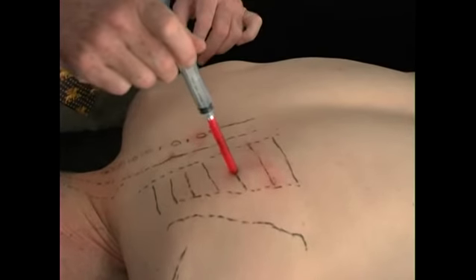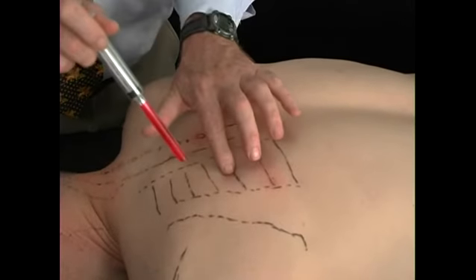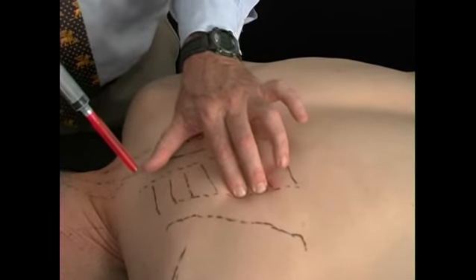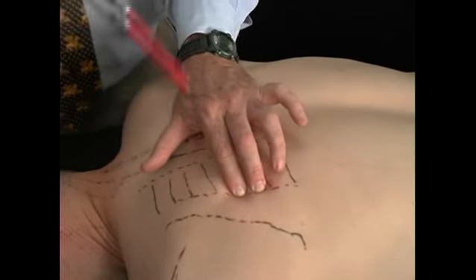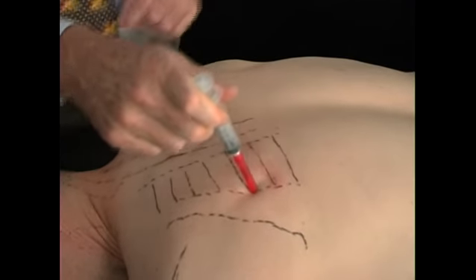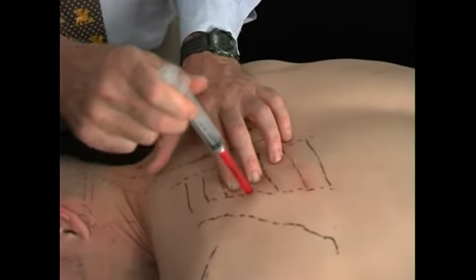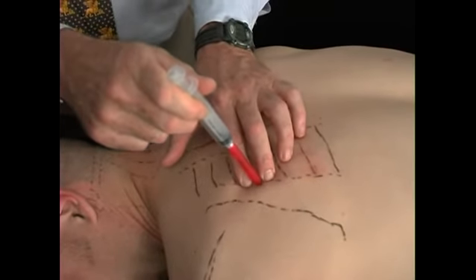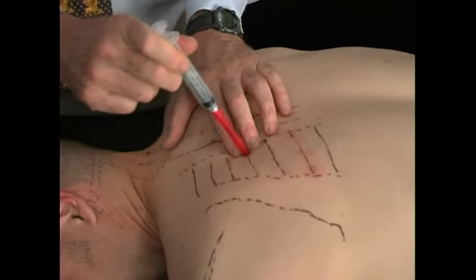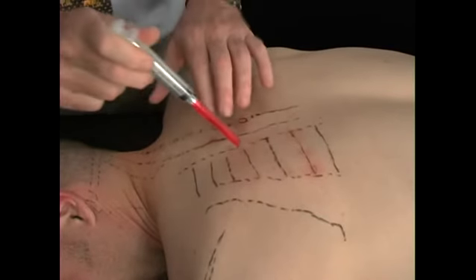If I were to come in where my line was without palpating again, I would be in the interspace between the ribs. So again, I come out to where I can really feel the rib at the angle of the rib, come back in with my injection in this spot. We move right on up, and again following that same procedure, coming to the angle of the ribs where we can feel it, and walking across the rib, do 3 or 4 injections till we get to the rib transverse process junction and inject that area.